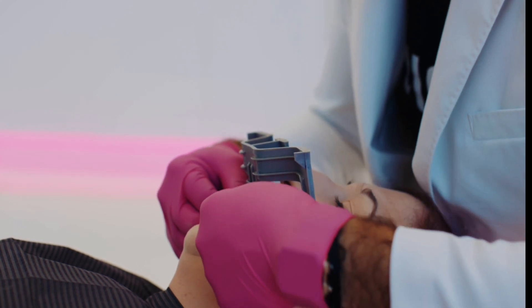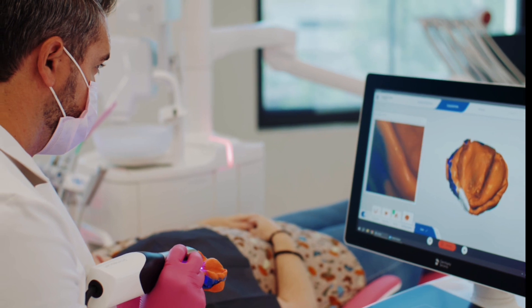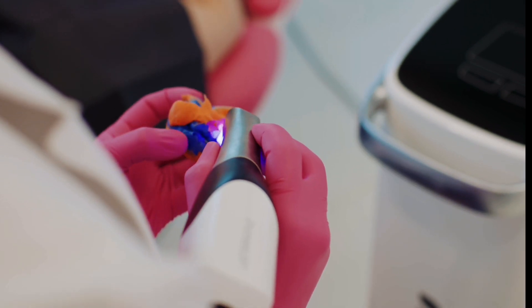Once we capture the maxillary index, we then simply unclick that fox plane and use a centric relation bite putty to capture the lower jaw into that maxillary index.